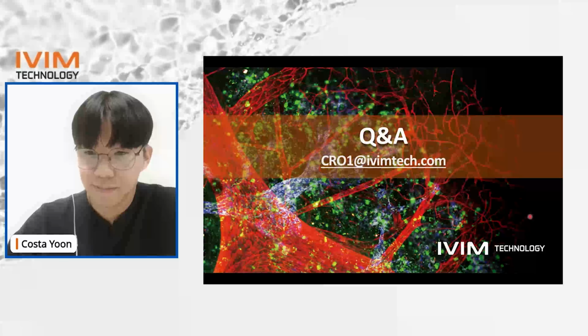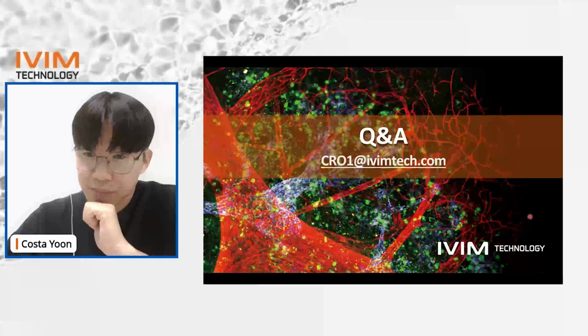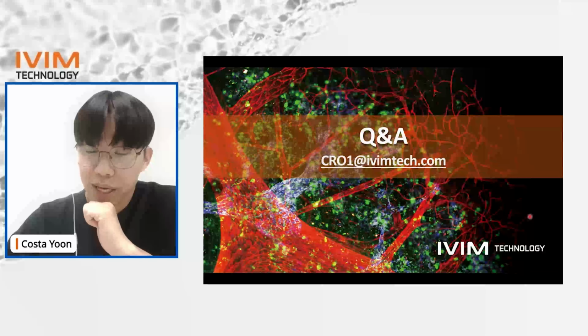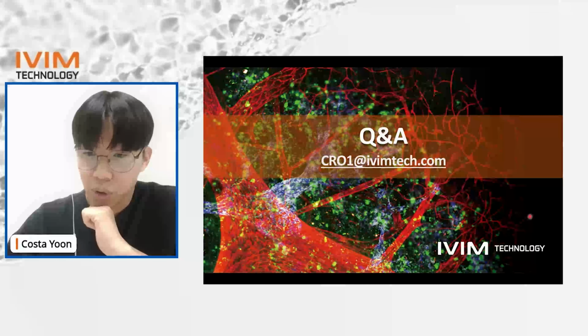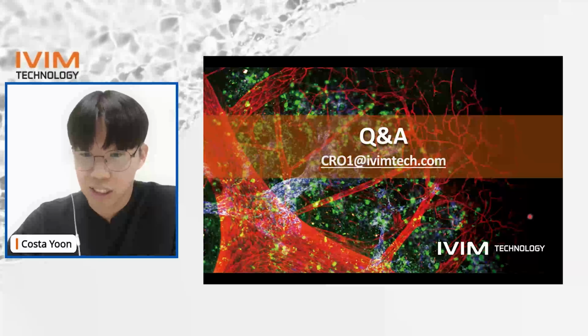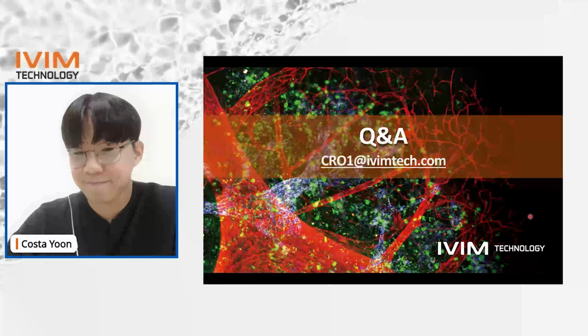And the second question is, what is the maximum imaging depth of intravital microscopy? Actually, the imaging depth depends on the animal model and degree of inflammation. But in general, we can image up to approximately 100 micrometers in confocal mode and 200 micrometers in two-photon mode. And with two-photon imaging at this depth, we can clearly visualize dermal collagen through second harmonic generation signal. This allows us to assess drug penetration into the dermis.